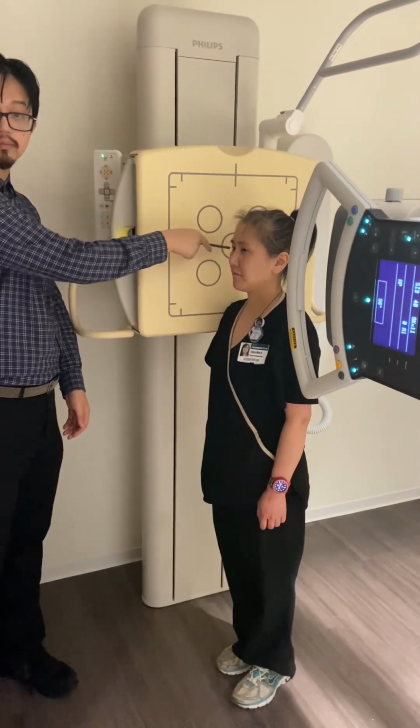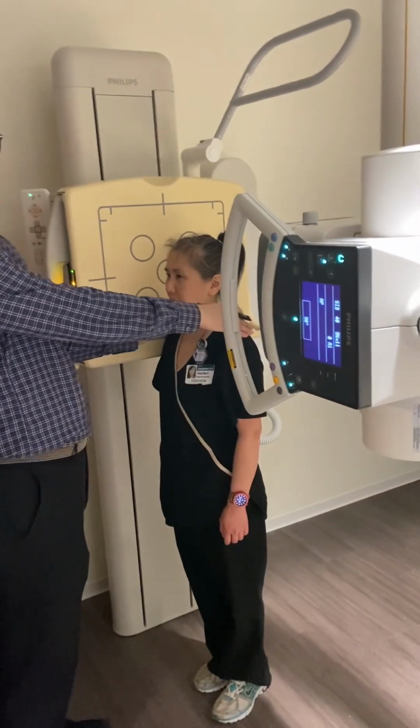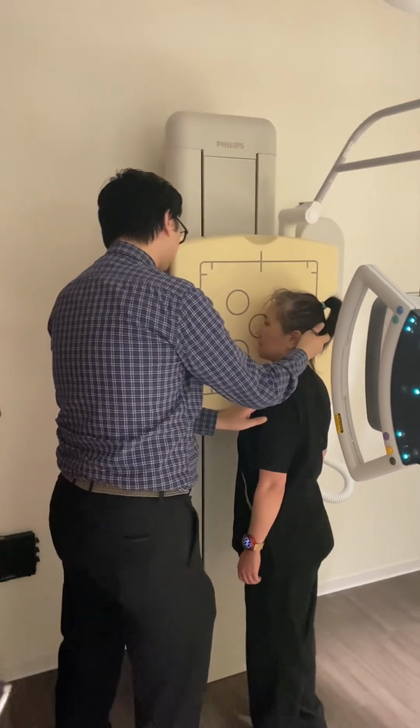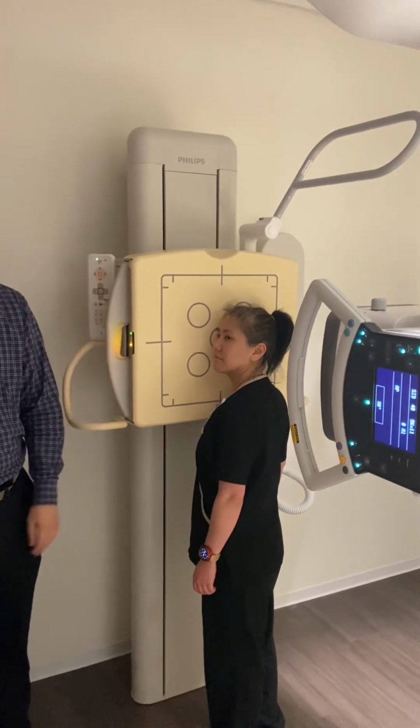OID. Yeah. Can't do this. What are we gonna do? We are gonna oblique the body, but make the head lateral. So, gonna turn this way, and then bring it nice and close. There, oblique body, lateral head.